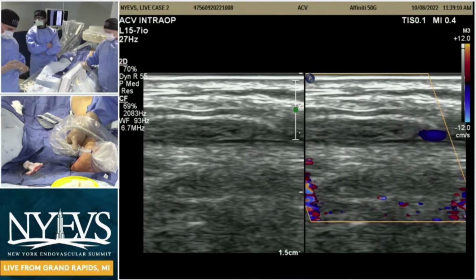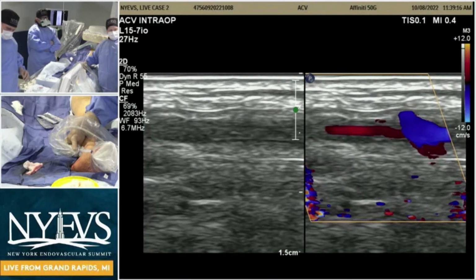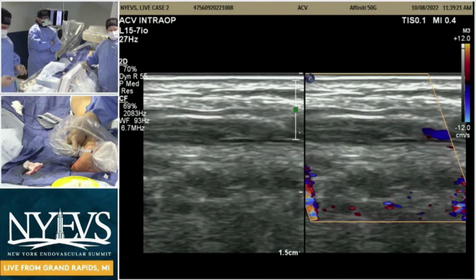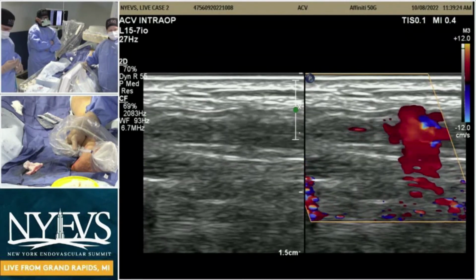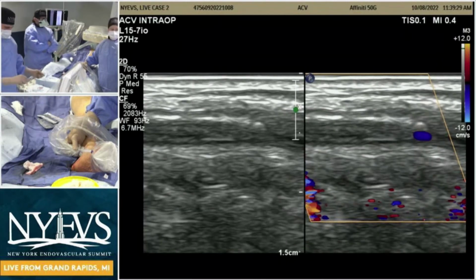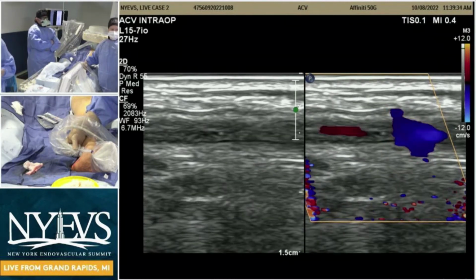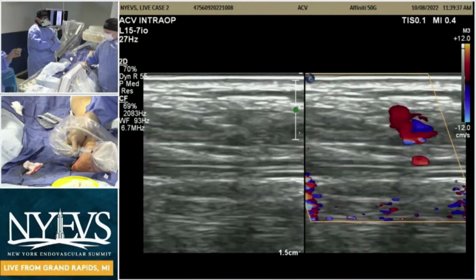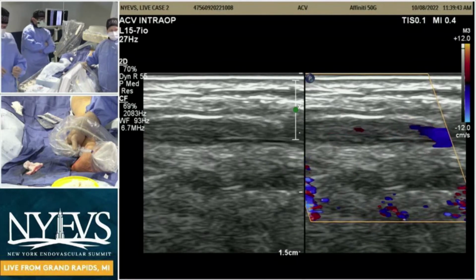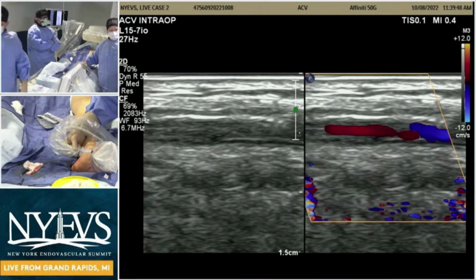Okay. The other question, any comments on IVUS from you guys? Yeah, I'm probably somewhere in the middle with IVUS. I certainly think it has huge value, and angiography is just two-dimensional luminology, and it's really not showing you everything that you need to know. I think it depends where you are. I think it's probably less important in iliac and large vessels where we do understand a lot. But I totally agree in tibials. I try to tell all my fellows, and I used this phrase upstairs in the aortic session, you've got to use all your senses, right? And angiography is only one of those senses, and IVUS is another one, and extravascular ultrasound and other cues that you can get.